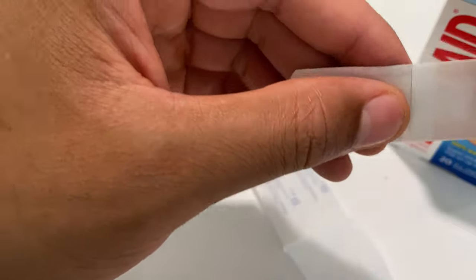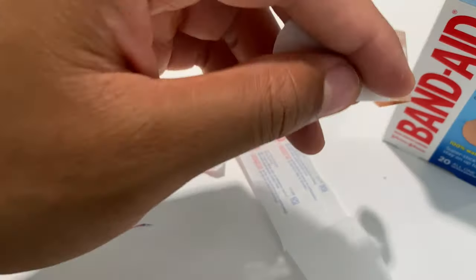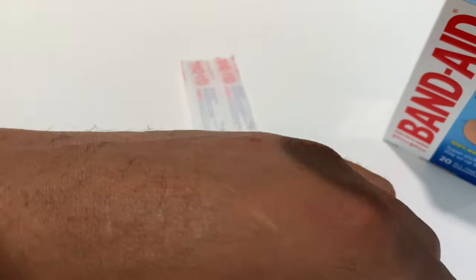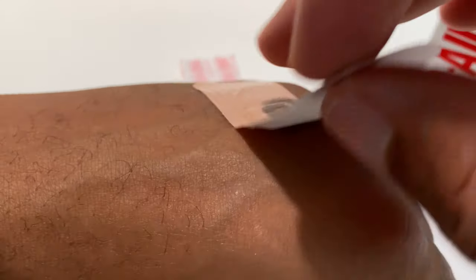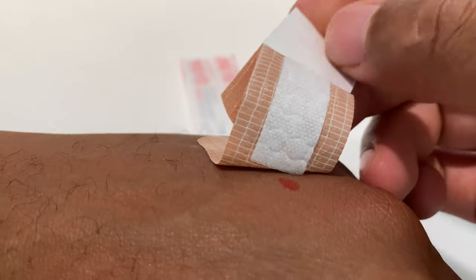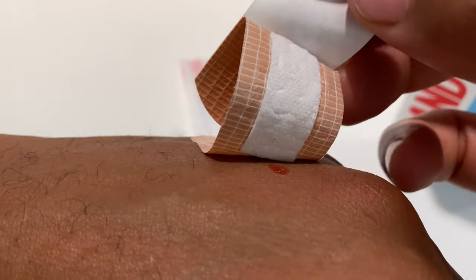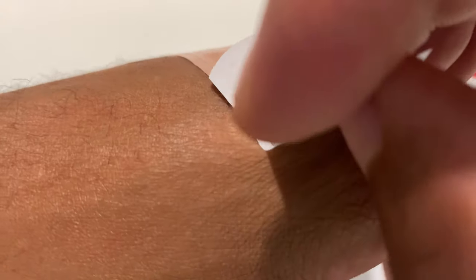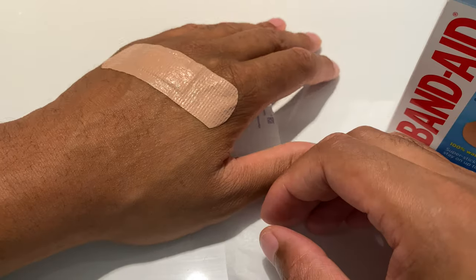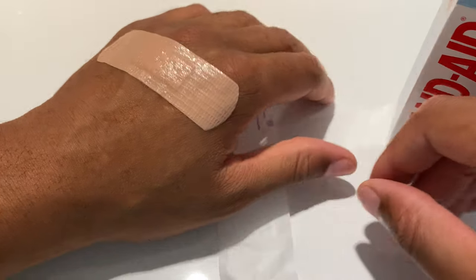I'm going to apply this to my skin. I'll peel this back and mark on my finger to show a wound — that's my wound. I'm going to take the bandage and place it right upon the wound, making sure that the white cotton part is on it. I'll just lay it down like that. It looks nice, feels nice — almost flesh tone right there.